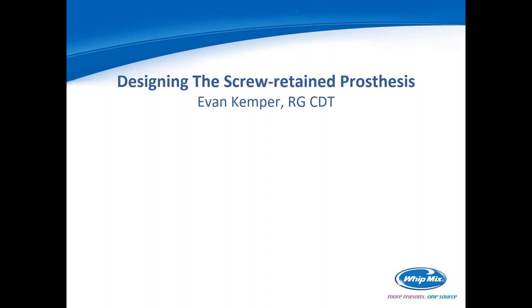What is the turnaround time in building a crown with this software? So the turnaround time for building a crown in 3Shape, or this kind of restoration, typically, I think a lot of labs, if the dentist is local, you're looking at around 4 days. You can do quicker, but that's going to depend a lot on how you have your digital setup done, because once you're familiar with 3Shape and you're used to the tools, your single unit crowns you can pump out in under 10 minutes if you've got a decent designer.